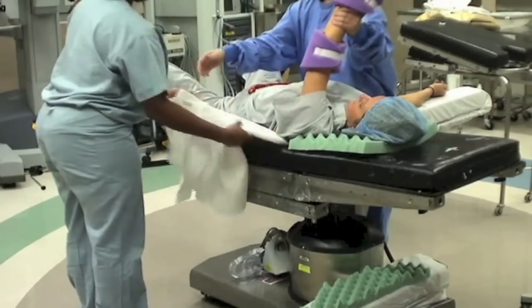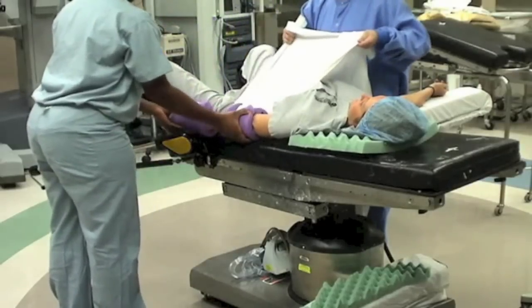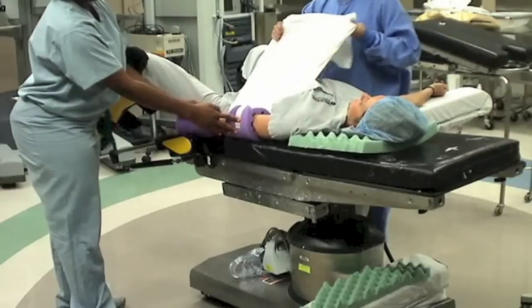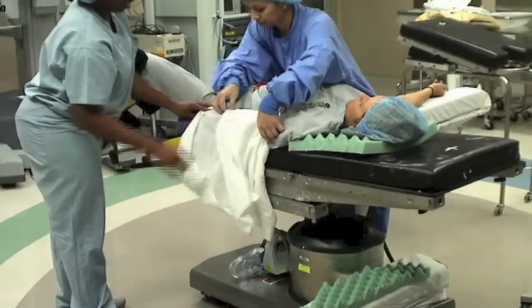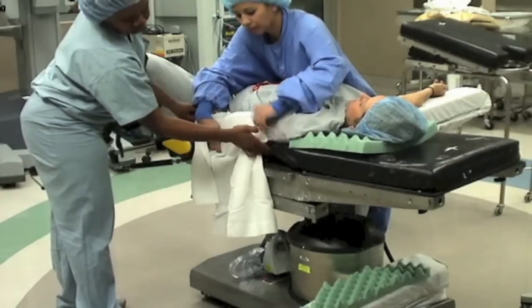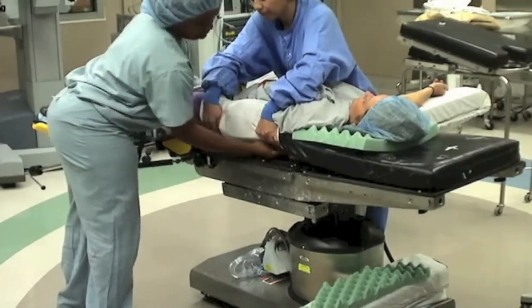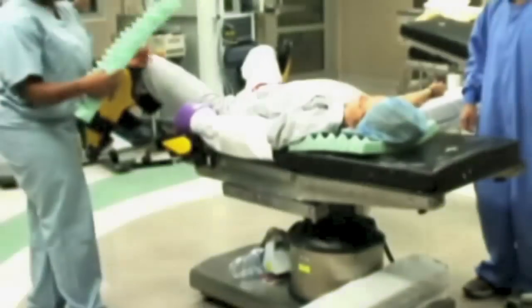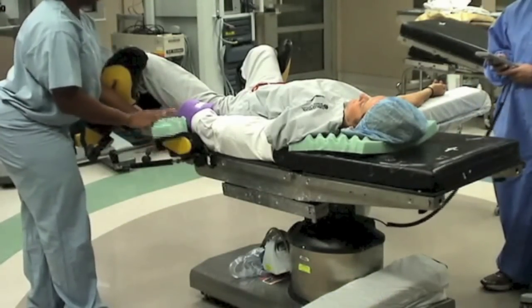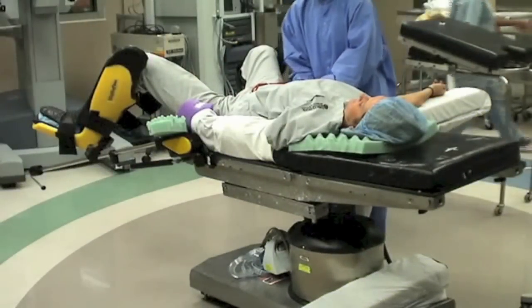The bed sheet is lifted up over the patient arm and tucked beneath the mattress pad with the patient's hands pronated. The excess egg crate foam is placed beneath the patient's hand. Do not allow the arms to hang over the side of the bed.